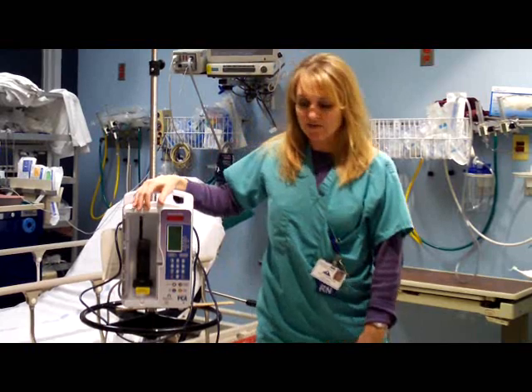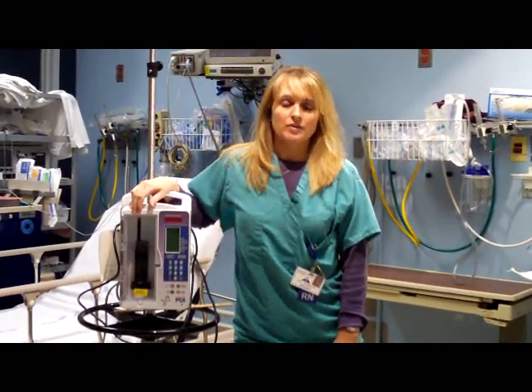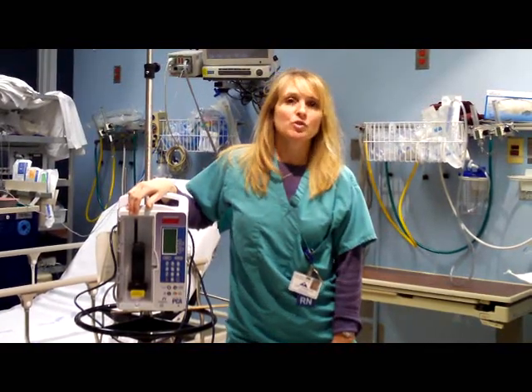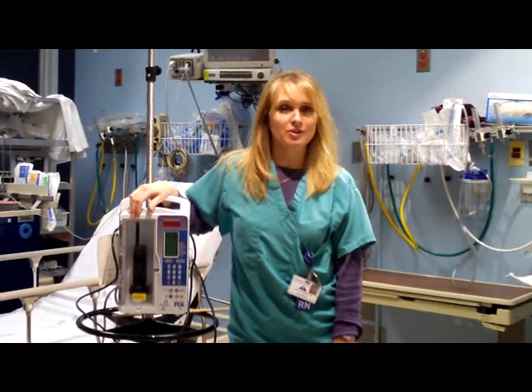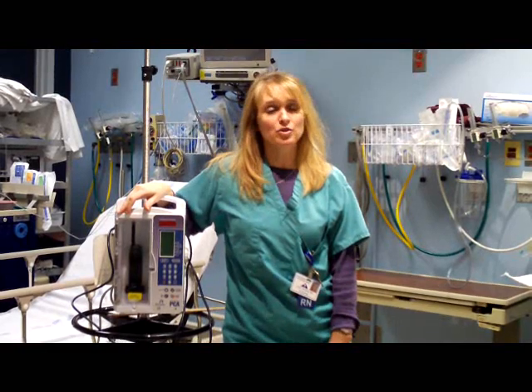As far as patient safety is concerned, prior to ordering a PCA, the doctor will have to make sure that the patient is an appropriate candidate. Young children, elderly, obese patients, confused patients are usually not a good candidate. Next thing that needs to be checked is for patient allergies.